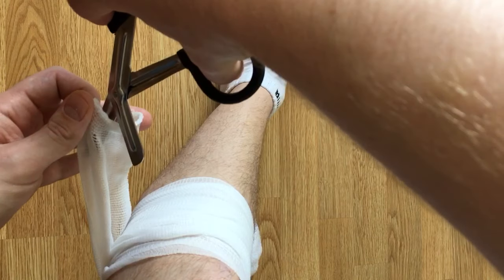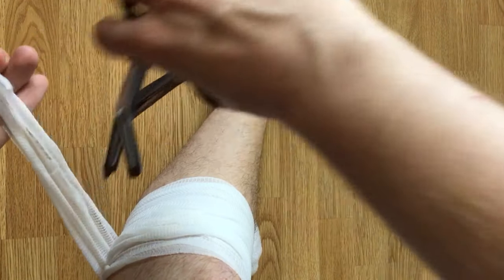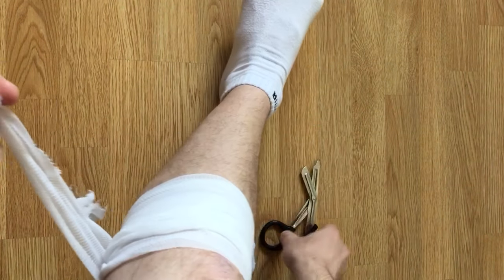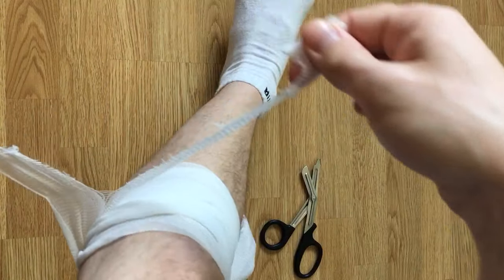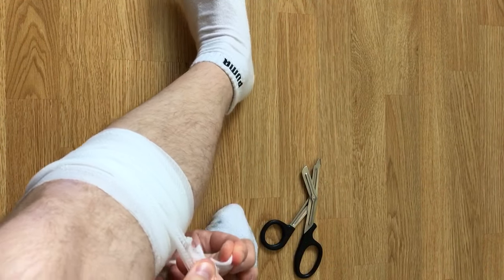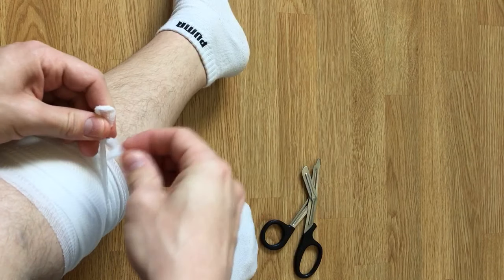You cut it down the middle. Now you have two pieces of gauze, and then you simply tie it off.